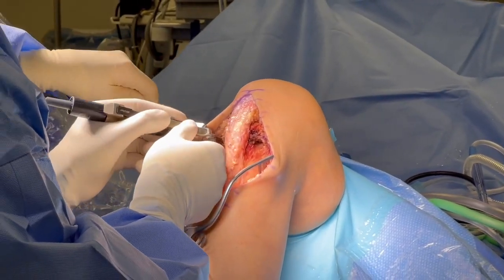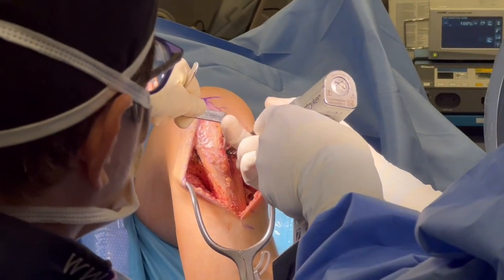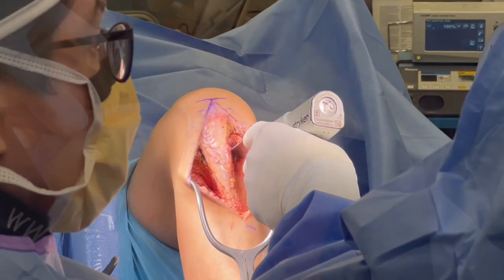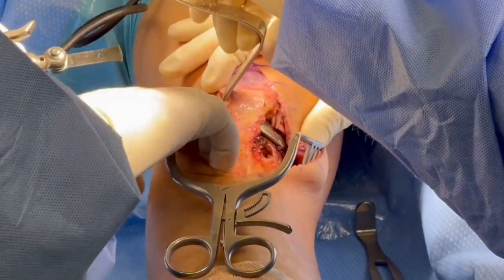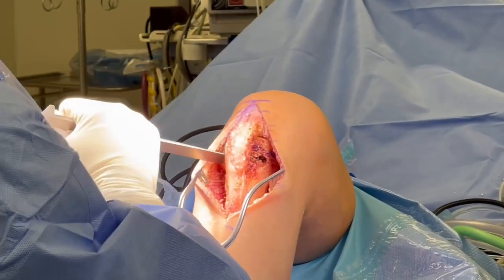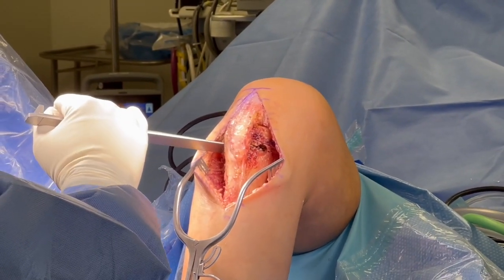We've placed these pins in trajectory together, and then we're going to use a larger saw blade to go above and below the cuts. This is going to continue to finish our cut. These are difficult as they're closing wedge. You're going to go into full extension here so that you can finish off the cut underneath the tubercle, and the key here is to be low enough that you have enough purchase to place a plate and compress down.